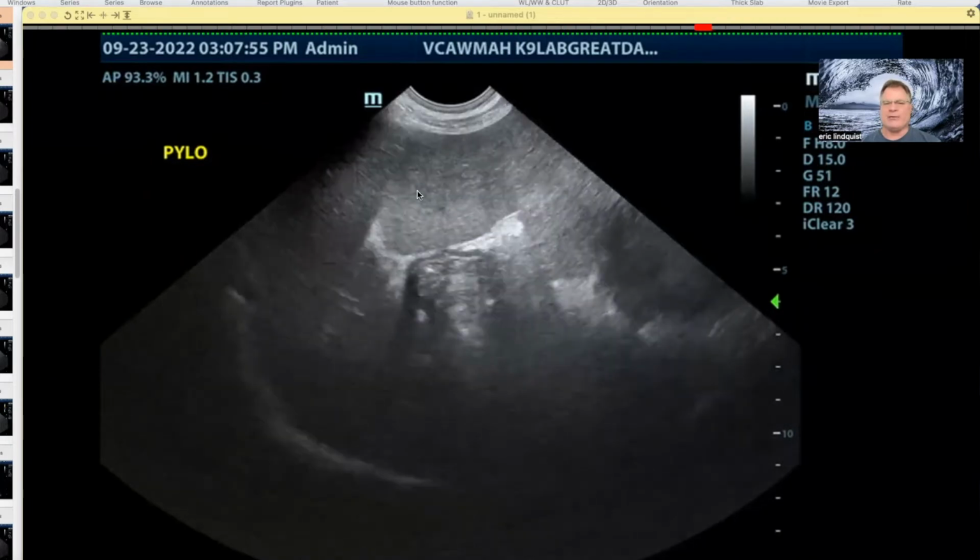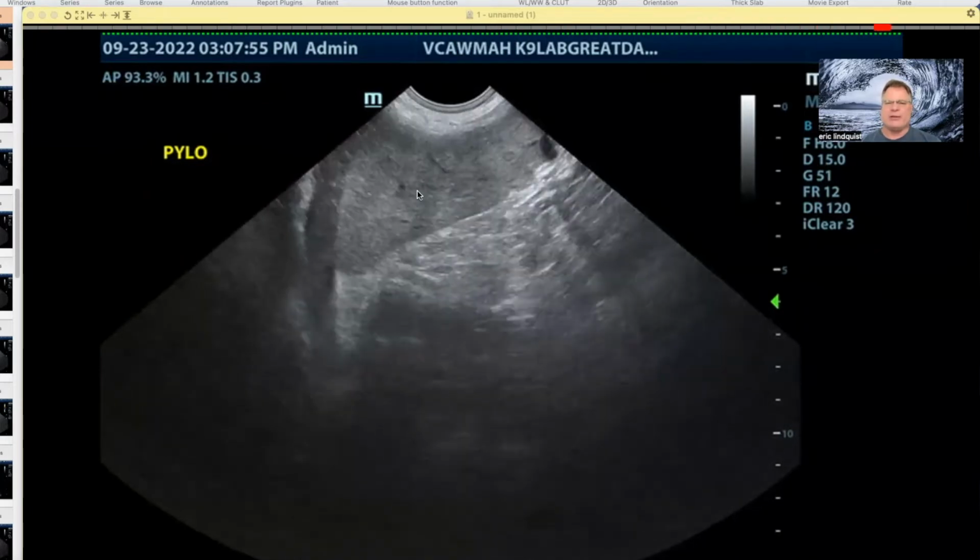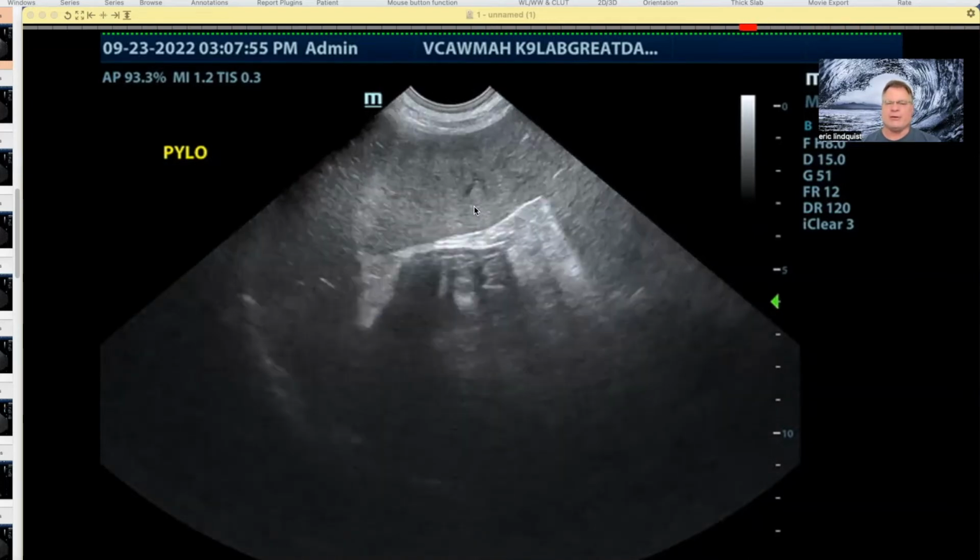and this is why we always make a definitive diagnosis on video clips, because we can move back and forth. So this is a splenic hilus. So I know this is spleen. It's a little bit heterogeneous. There are these little micronodular, capsular, expansive pathologies going on, which is concerning.